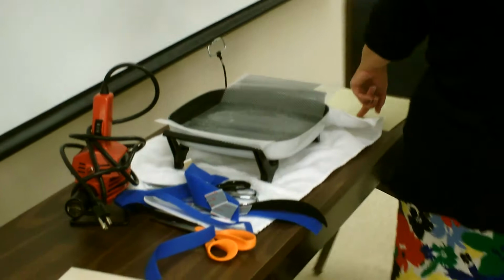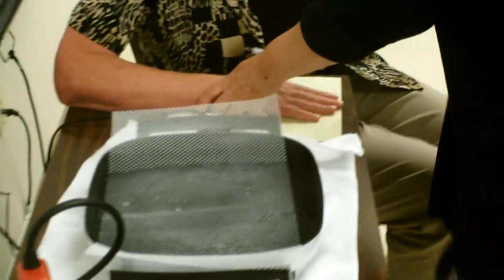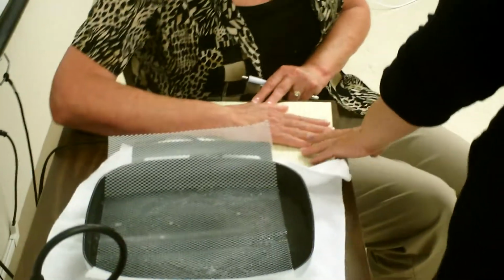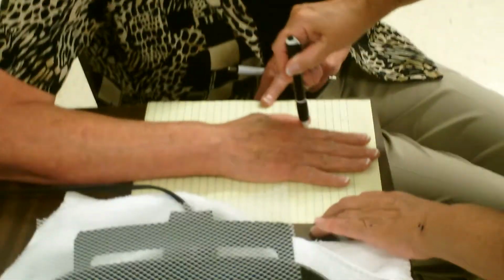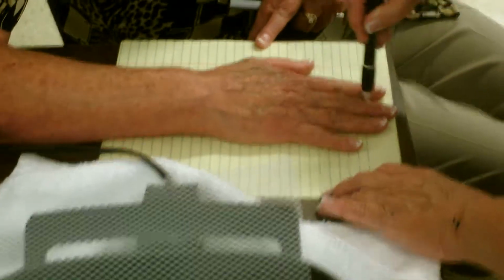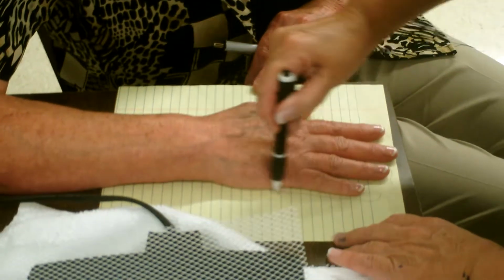No, let me do this. Oh, it's getting hot. Okay, so, right, have the patient flat on the table. Draw the hand. And you can come wherever you need, Michael. And you don't even need the hands.